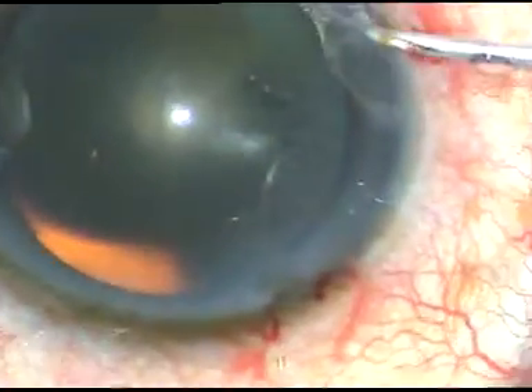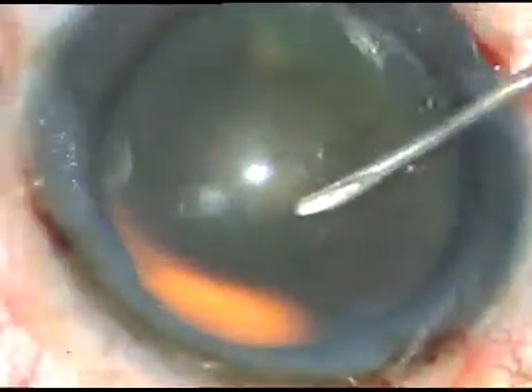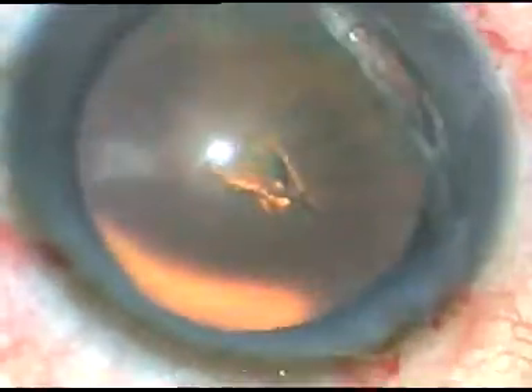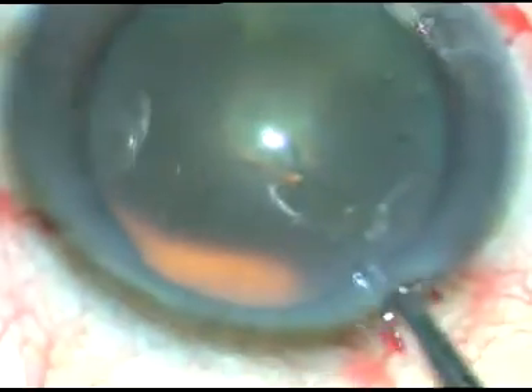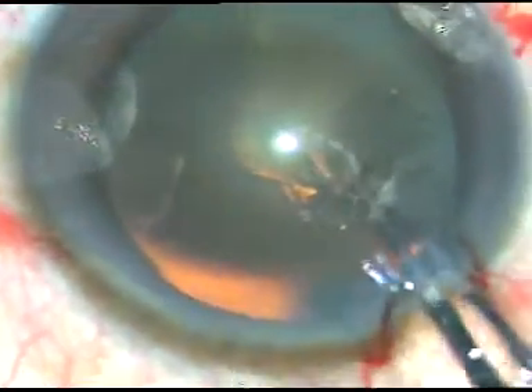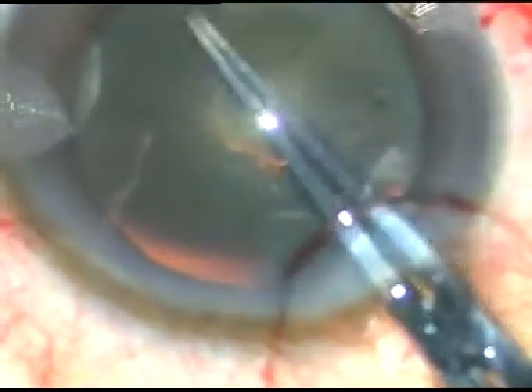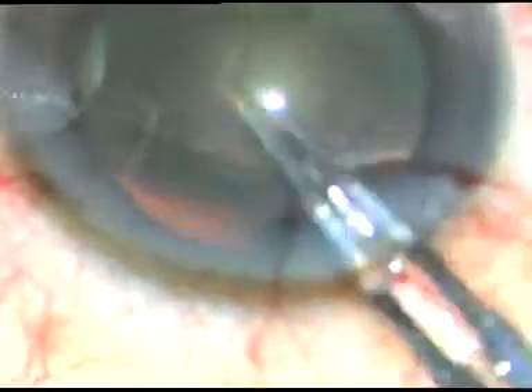By this time, all the incisions have been made. Now I am doing capsulorrhexis. In the lens tilt technique, the capsulorrhexis should be large — about 6 mm — so that the nucleus can prolapse out of the capsular bag by hydrodissection.